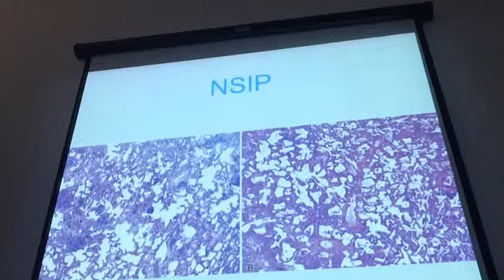So here we see, this is a more diffuse process, right? This is the chronic cellular infiltrates pattern. Remember that? And although it's got some lymphocytes in it here, we really don't see much in the way of real fibrosis here. There is some thickening of some of these septal areas so that we might be suggestive or worried about fibrosis, but it's not that mature fibrosis and dense scarring, and there's no smooth muscle like we would see in UIP.